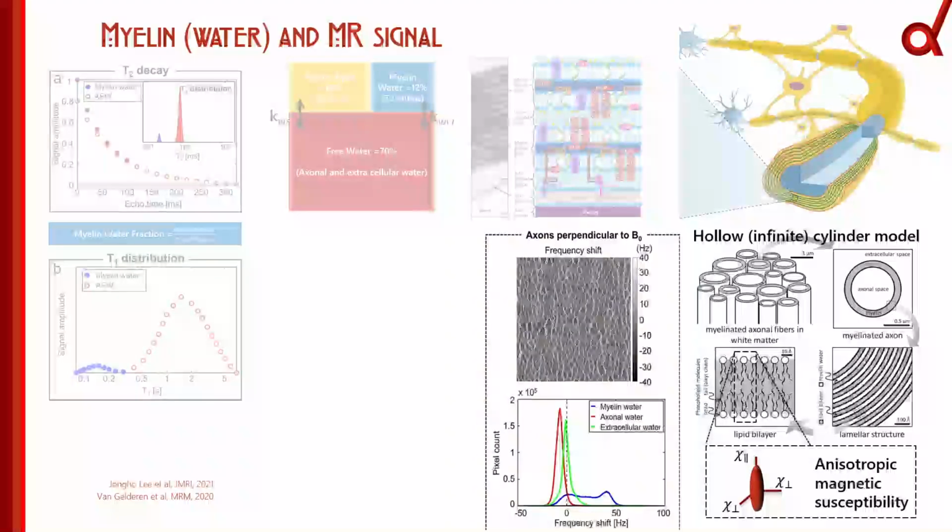So if you look here, this is an example of a 3D EM, and you see that as soon as you introduce these magnetic materials inside the scanner, and this is with a bundle of axons which is perpendicular to the magnetic field, suddenly you have a different color of the intraaxonal compartment versus the extraaxonal compartment. The intraaxonal compartment is darker. And this is what starts giving us a chance to use gradient echo signal to see G ratio, because it's starting to separate this free water compartment into an axonal compartment and an extraaxonal compartment.